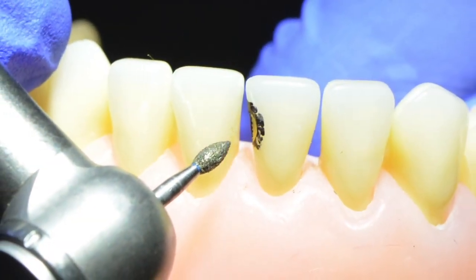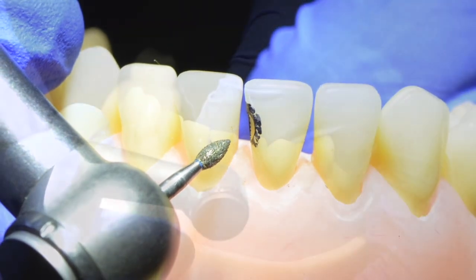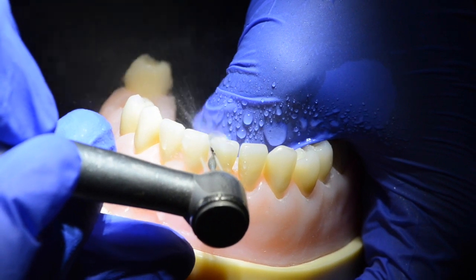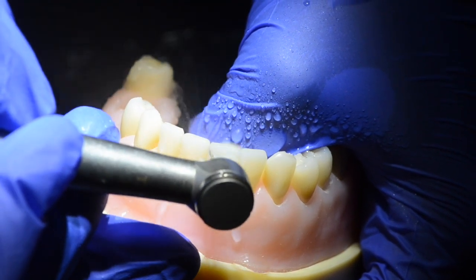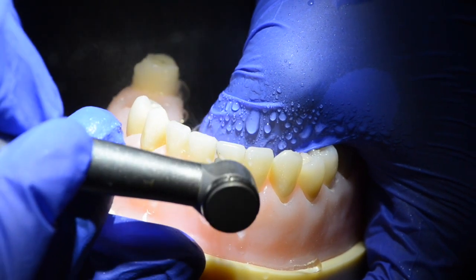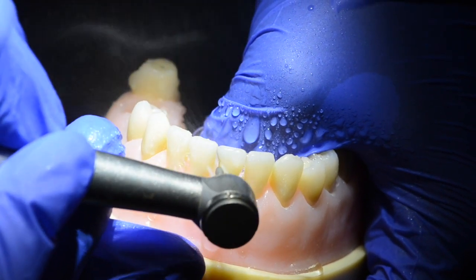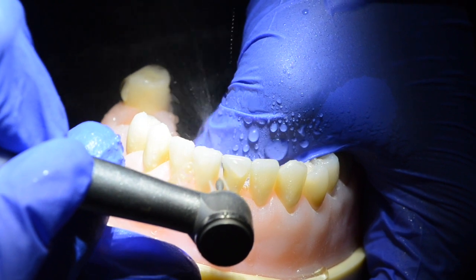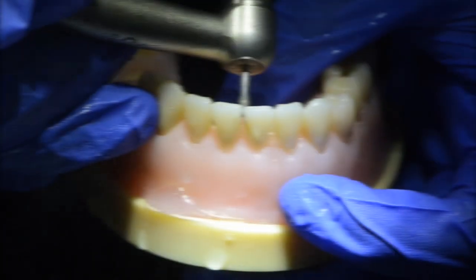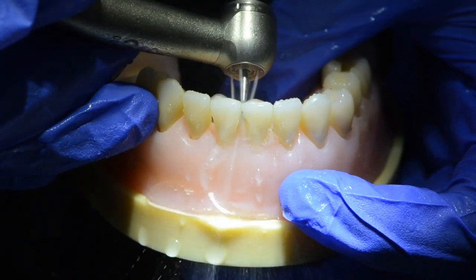The problem I see with this minimal bevel is that it does not allow us to harness the adhesive superiority of the enamel-resin bond. Moreover, this bevel will not in most cases help you mask the cavity margins — it will also make you leave unappealing, unesthetic resin Class 3s.